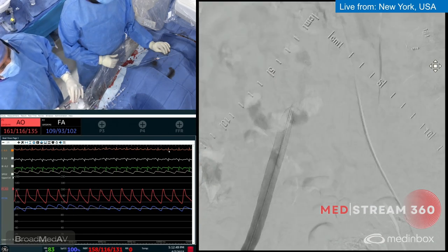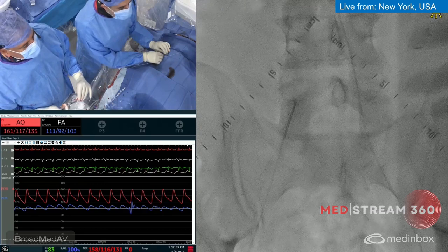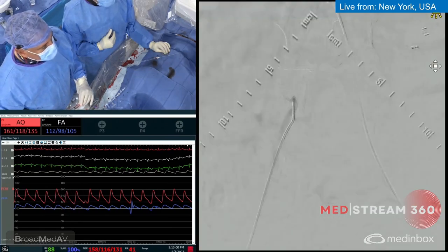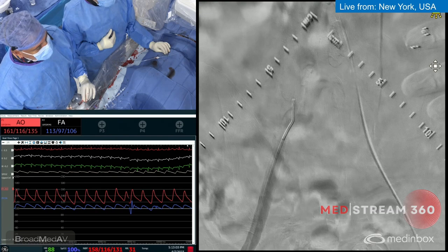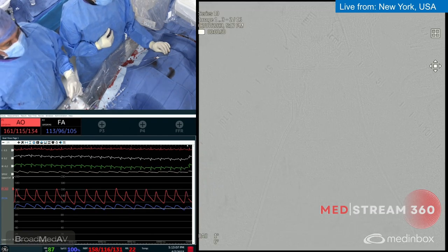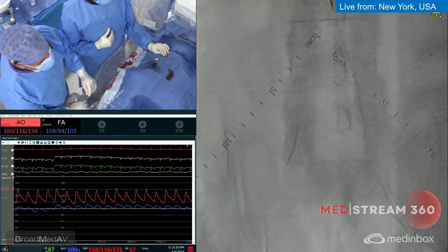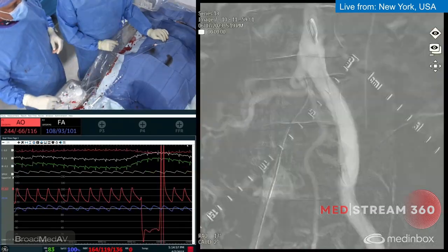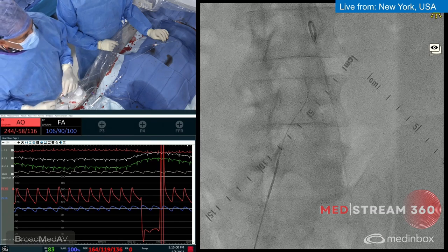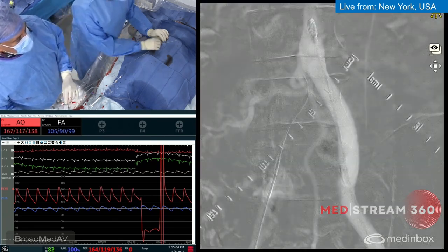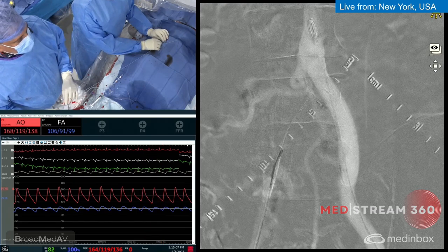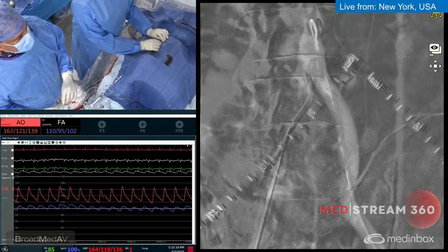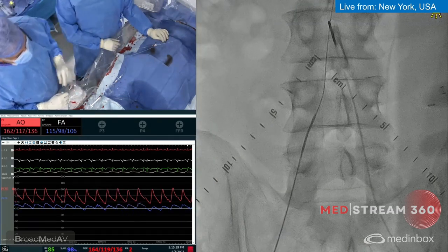We have a little nipple at the beak, so I'm going to advance as Vishal pushes forward slowly. You can see the dissection plane. The question is whether that's a collateral or a dissection. Give me a straight glide — stiff, straight, stiff. We're going to try to dissect through this. It looks like it's moving in this direction, so we'll advance the catheter. Any resistance? No — nice and smooth. I think we've crossed a good deal.